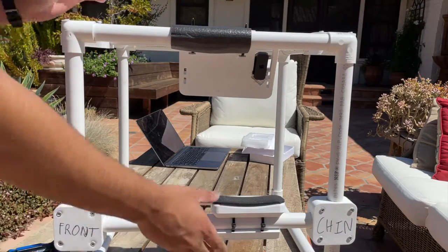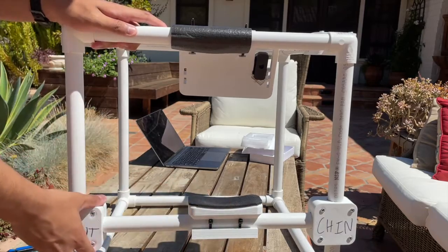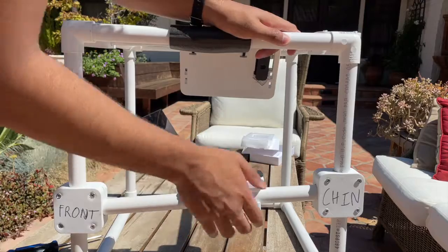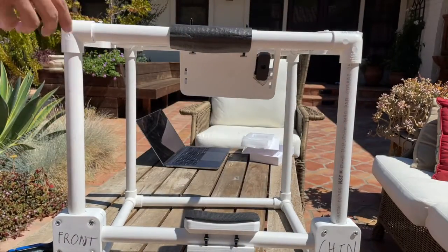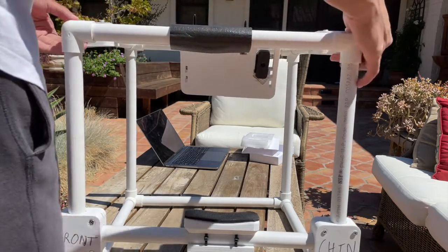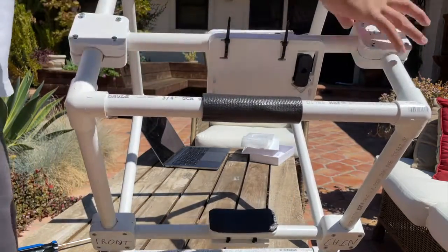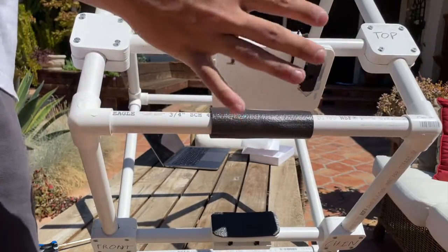The first point of movement is the chin rest, which slides left and right in order to move the patient. The second point of movement is the chin rest holder, which moves up and down to adjust the patient and make sure their forehead is on the padding at the top. The third point of movement is the phone slide, as that slides left and right to adjust to the eyes. And the fourth point of movement is the top bar, which is going to move back and forth in order to get the right distance from the camera to the eye. This is not going to move very far, but that's how you do it.